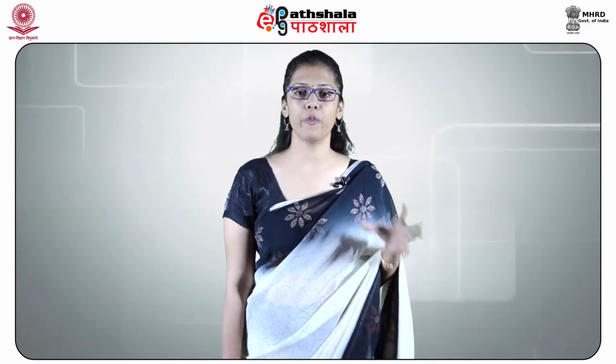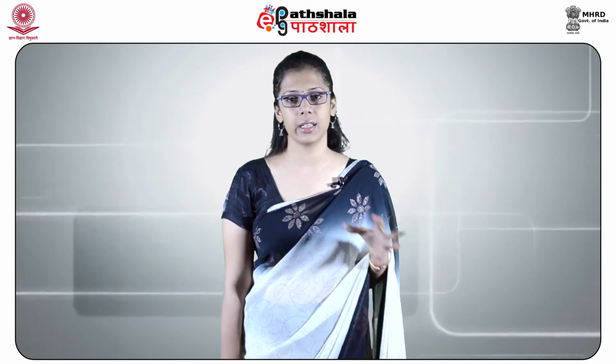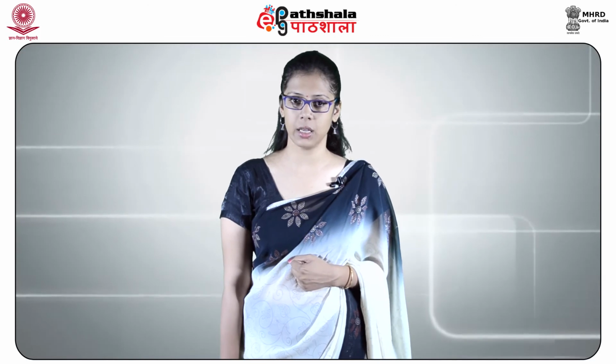All of the methods that detect P30 rely on the formation of an antibody-antigen complex. If semen is present in the stain, the binding of P30 to the test antibody produces a visual result. The lack of a result in any of the tests would indicate that the stain does not contain semen, or that not enough is present to facilitate a visible reaction. This test can be used alone to confirm the presence of semen, or it can be used in conjunction with the microscopic method described in the previous section.